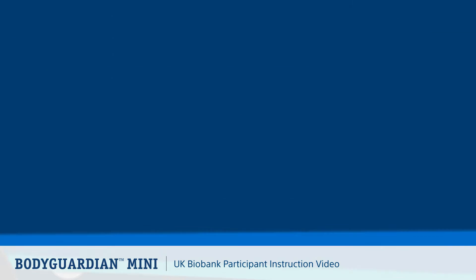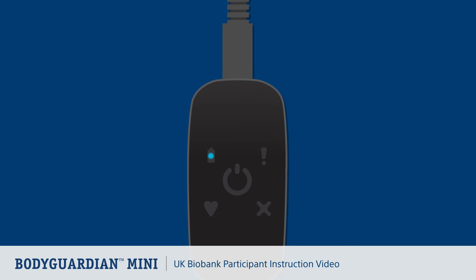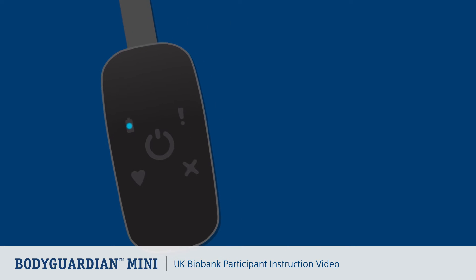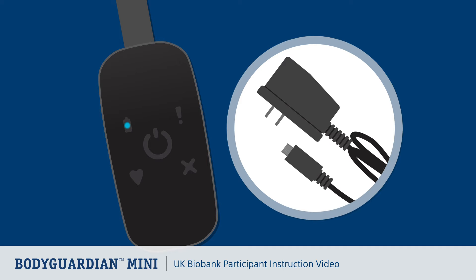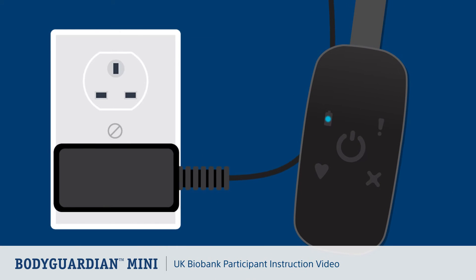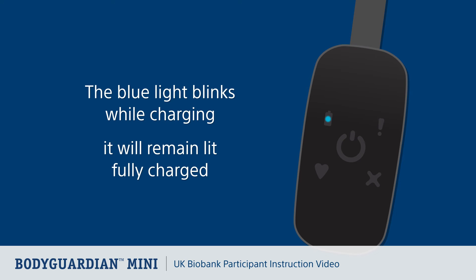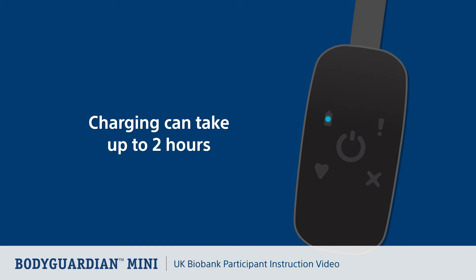Now let's go through the instructions on how to charge your Bodyguardian Mini monitor. If you've been given a charger, please charge the monitor before first applying it. Plug the monitor into the charging lead and ensure the other end is plugged into a power outlet. The blue light on the monitor blinks while charging and remains lit once fully charged. Charging time can take up to two hours.